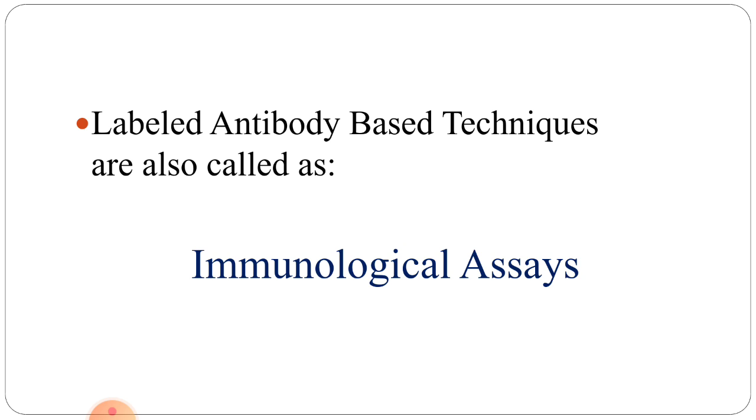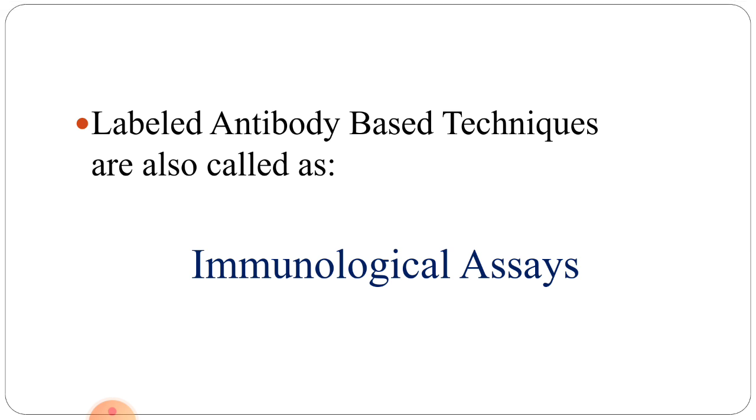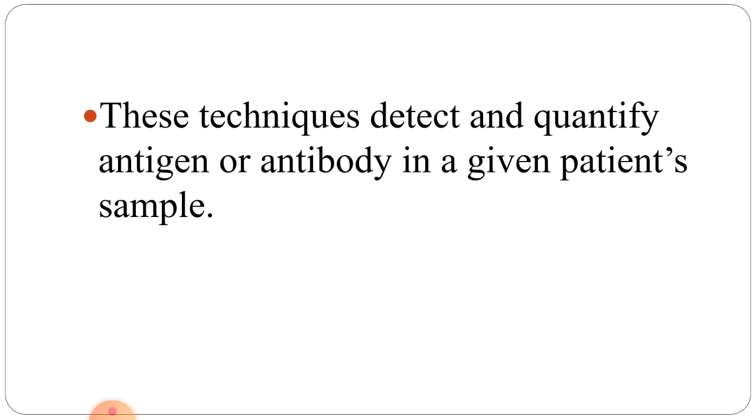Labeled antibody based techniques are also known as immunological assays. Immunological assays have always represented a major contribution in the diagnosis of infectious diseases. These techniques detect and quantify antigen and antibody in a given patient's sample.